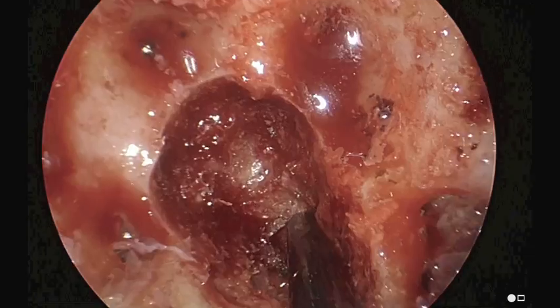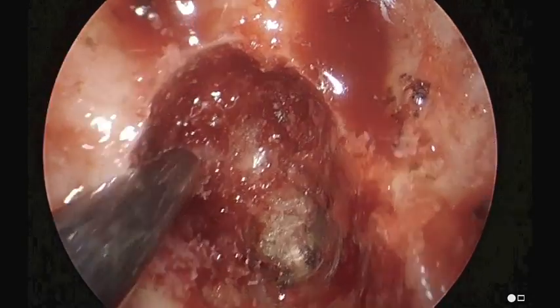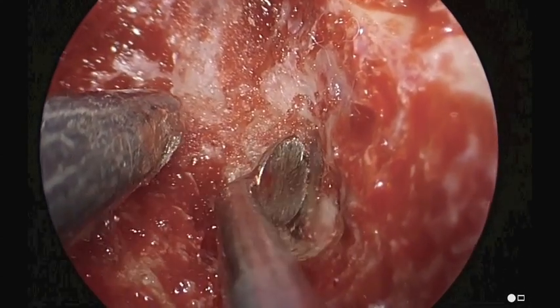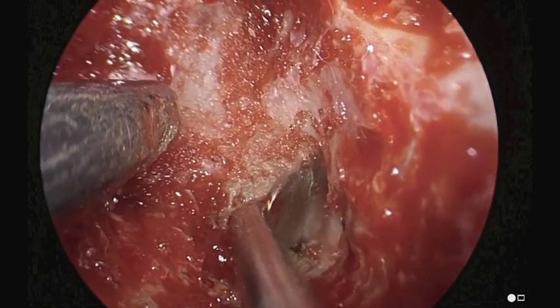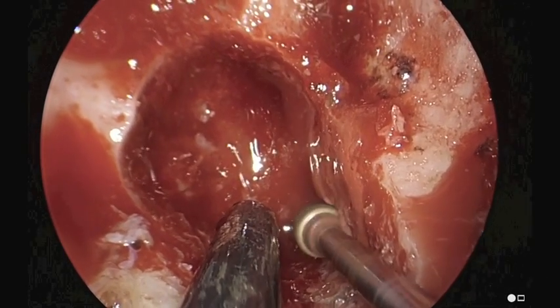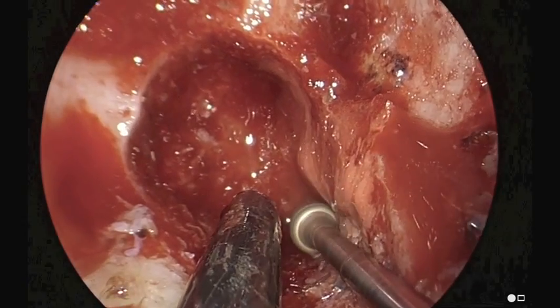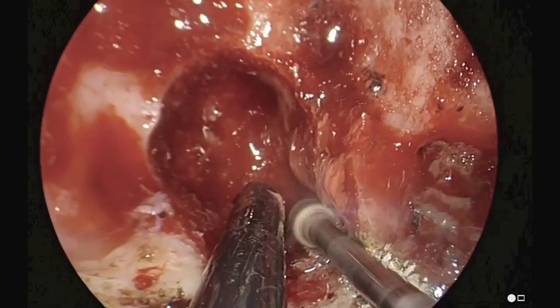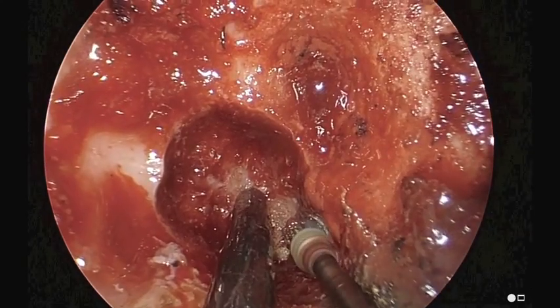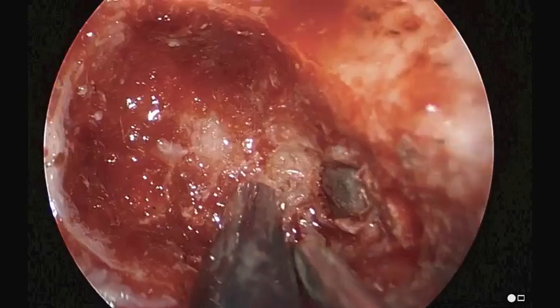We still have to undercut a little bit until we can expose that cyst wall, which we see here. Our bone exposure is about four to six millimeters in size. We can't go any further posteriorly, and we're at the tip of the apex here. We've exposed that opening.